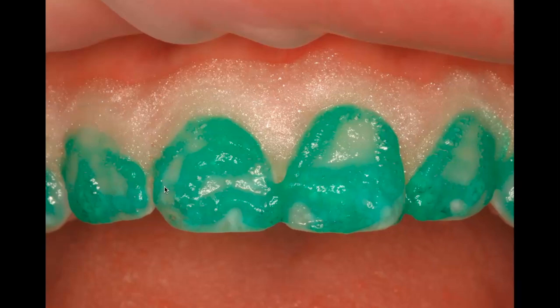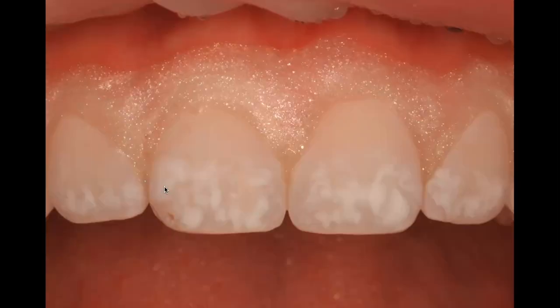Now, we're never going to numb these patients because if they're starting to feel sensitivity, we want to know that. But there's quite a bit of microabrasion you can do without causing any type of sensitivity. So you can see here, now that we've done that initial hydrochloric acid microabrasion etch, you can see those lesions even more, which again is a good sign. It means that we're accessing a deeper portion of the tooth.